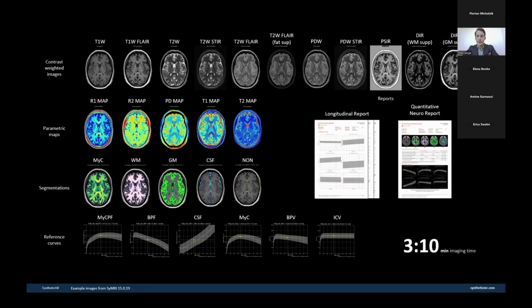Scan time, of course, varies a little bit between MRI machines, field strengths, and settings used. But if you have access to AI acceleration techniques like on Philips SmartSpeed, you can come down to as little as 3 minutes with a 1.2 millimeter isotropic resolution. And that's without any real manual processing needed.